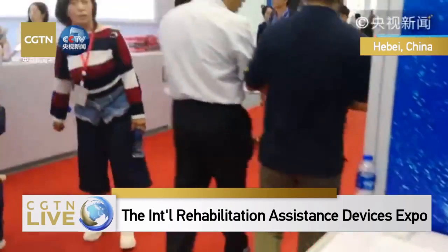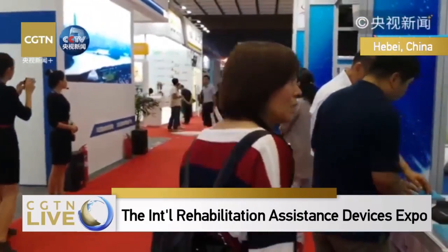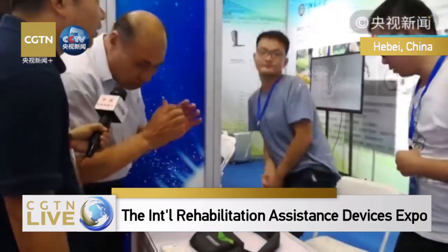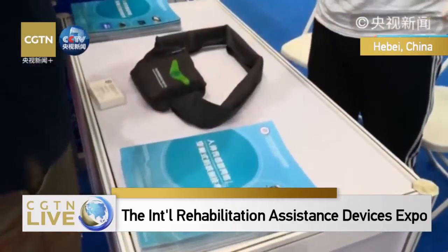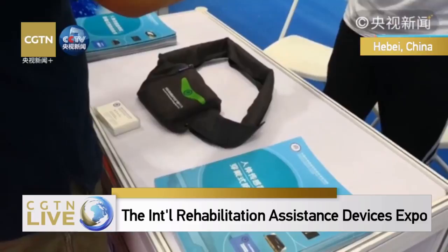Let's take a look at some other technologies. This is a device to prevent elderly people from falling down. So when someone falls down, the airbag can prevent severe injuries.